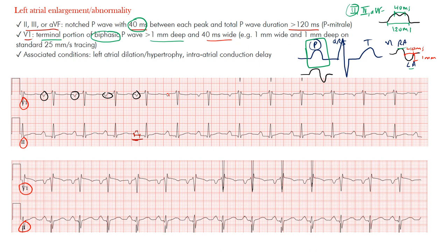Below we have another patient. Here's lead V1. In V1 we're looking for the criteria: one wide and one deep. Look for one millimeter wide and one millimeter deep. Here are perfect examples — look at how wide and deep these P waves are, especially that terminal portion, which is the negative portion here. A few millimeters wide and deep. These are excellent examples of those P waves, and there is some notching in these as well. This patient did have severe left atrial enlargement.